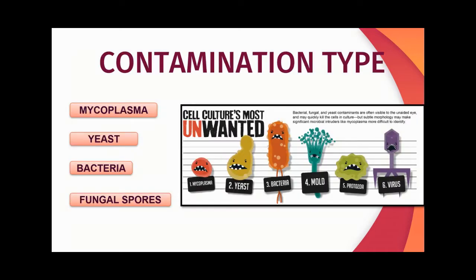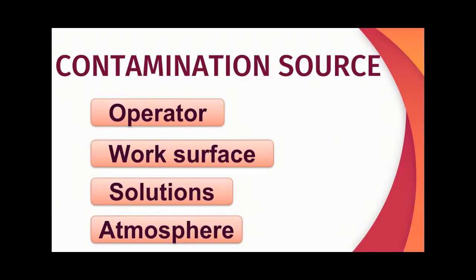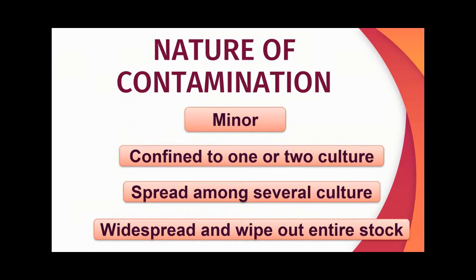Let us see the contamination types. Contamination by microorganisms remains a major problem in cell culture. The contamination can be caused by mycoplasma, yeast, bacteria, and fungal spores. It can be introduced via the operator, via the work surface, various solutions, and the atmosphere. Contamination can be minor and confined to one or two cultures, spread among several cultures and compromise a whole experiment, or be widespread and wipe out the entire stock.